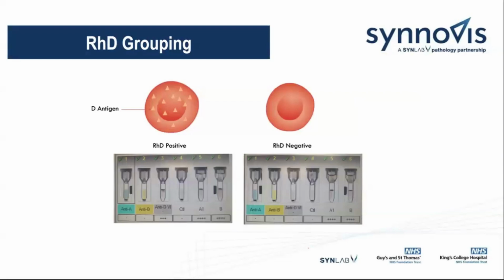So moving on to RHD grouping, you either have it or you don't. And so we test for this in the same way that we do an ABO group. The RH blood group is the second most clinically significant blood group after ABO, and this is why we test for it. This is where the positive and the negative part of the blood groups come from. And in these situations, it's therefore fine to transfuse an RHD positive patient with RHD negative blood, as they are completely lacking the antigen and therefore cannot cause an immune response.